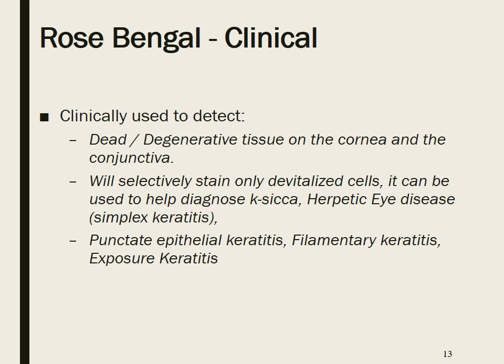Bengal selectively stains devitalized cells, and it can be used to help diagnose keratitis sicca, herpetic eye disease, epithelial keratitis, filamentary keratitis, and also exposure keratitis.